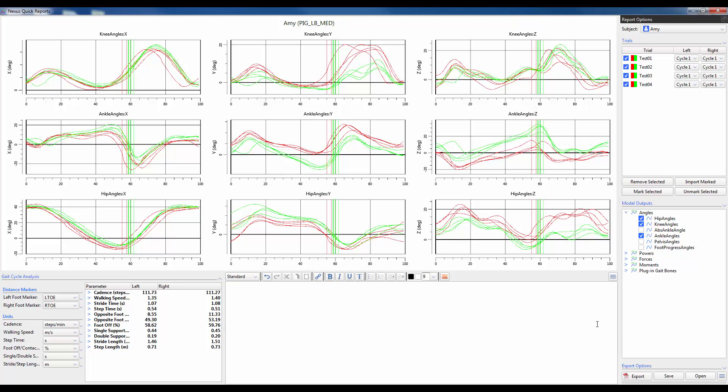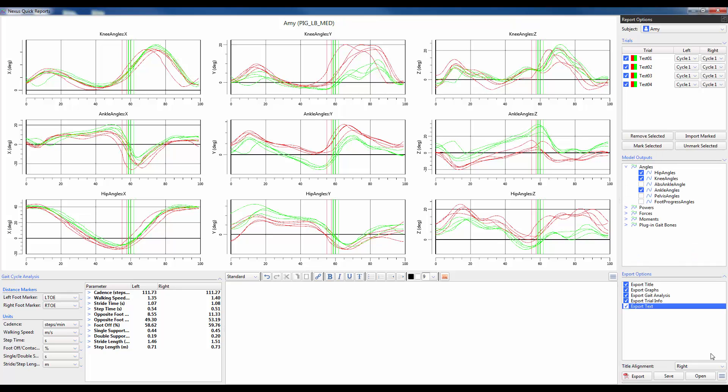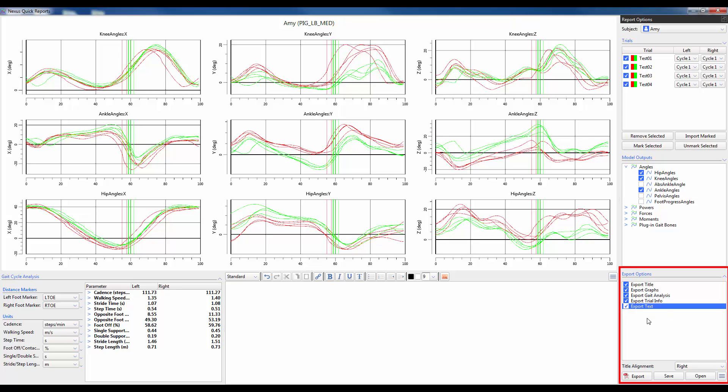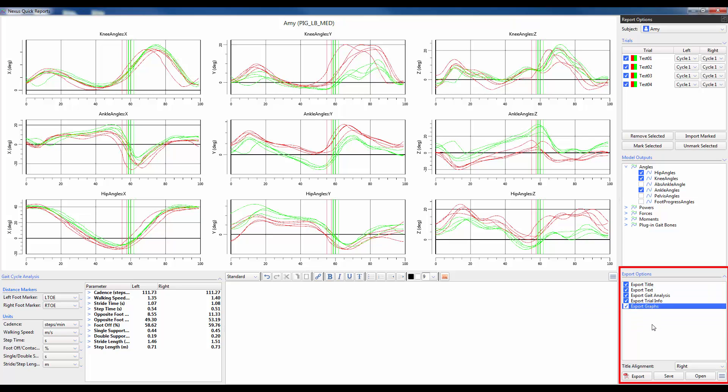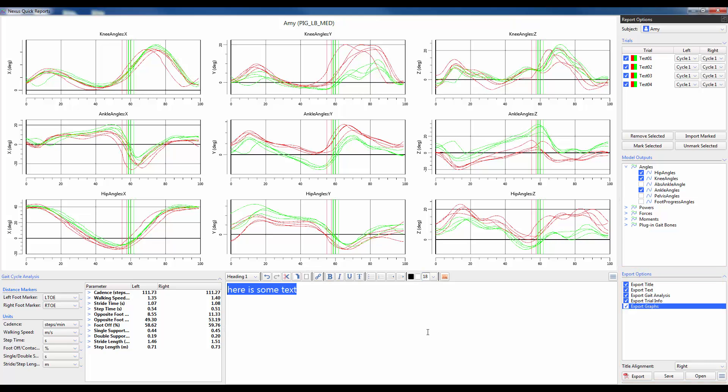Before you export the report, you can decide which sections you want to include and in what order you wish for those sections to appear within the report. To do so, expand on the export options and then use the check boxes next to each section to decide whether you want to remove or include that section. You can also drag and drop each section so they appear in the order in which you wish. So I'm going to move text up to just below the title and then move graphs down at the end. I'm also going to put in some text so we can actually see that reflected in our report. I'll just make it a bit bigger so we can actually see it.